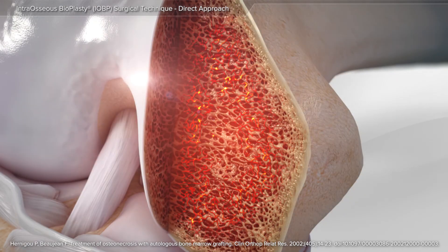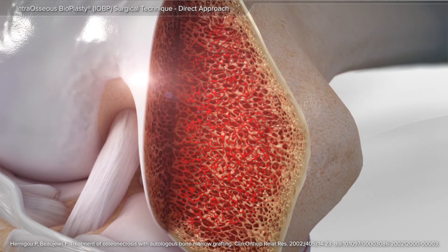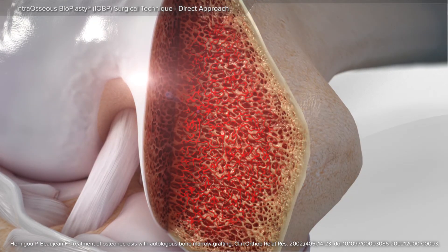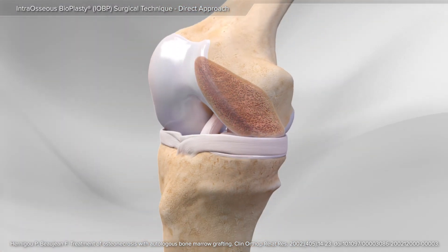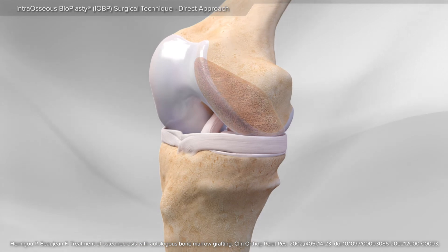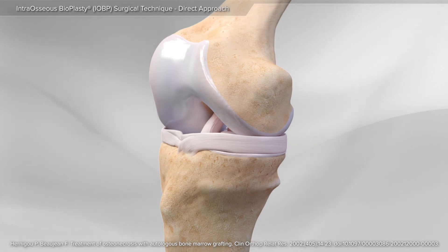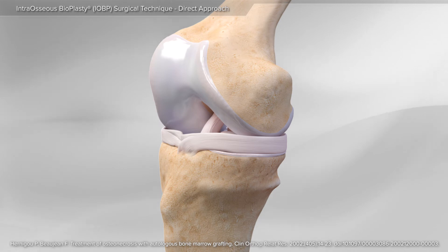Together, these provide the optimal environment to encourage new bone growth and nutrient blood supply to the area. This completes a bone marrow lesion repair using the intraosseous bioplasty procedure.